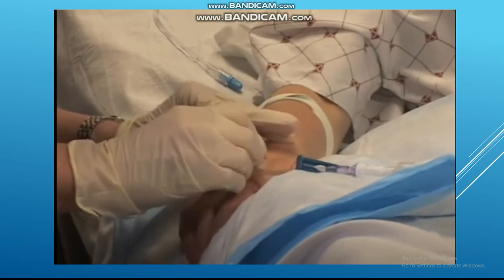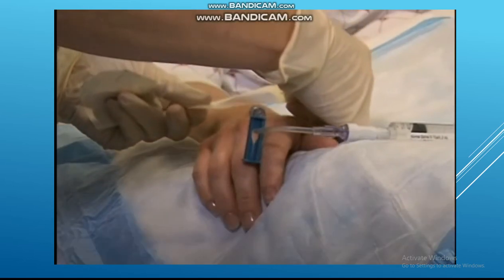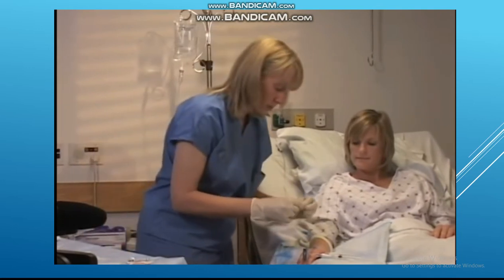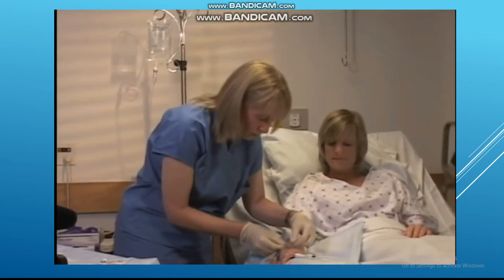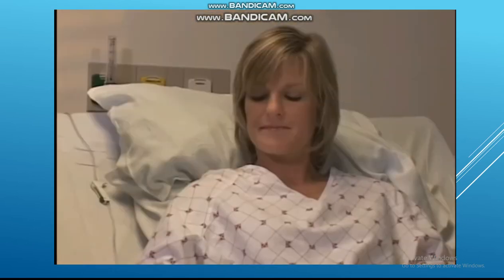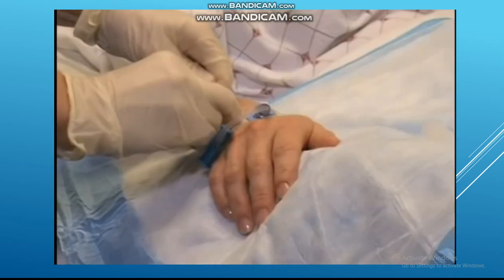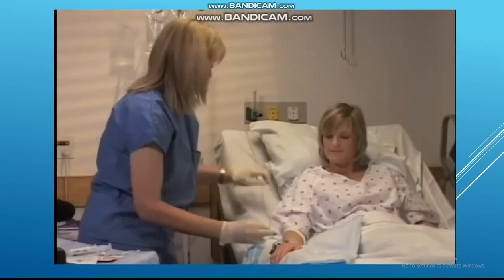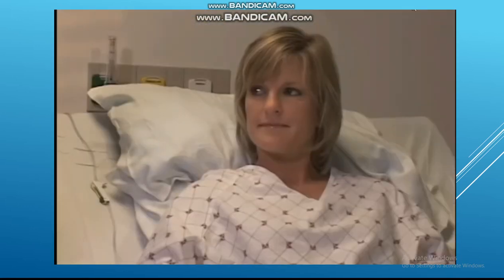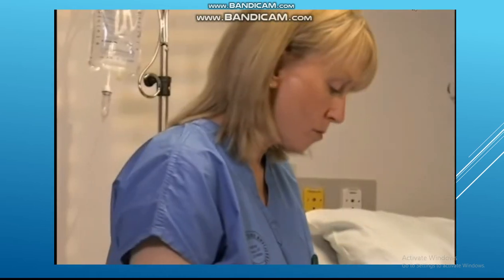Attach the IV line. It's preferable to use a saline flush before attaching the IV line, and then fixate the catheter with a transparent dressing and an additional fixating clip. The IV line can be started now. Remember to record the procedure, the date, and the initials of the person who installed the catheter.